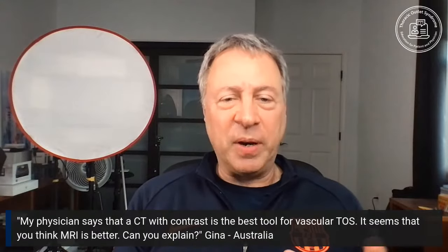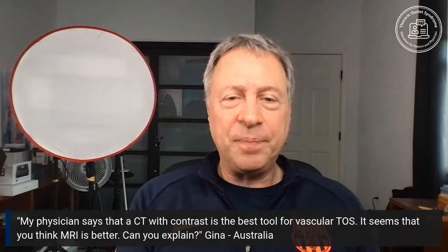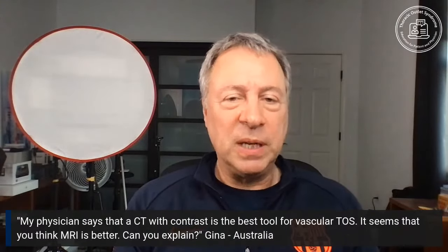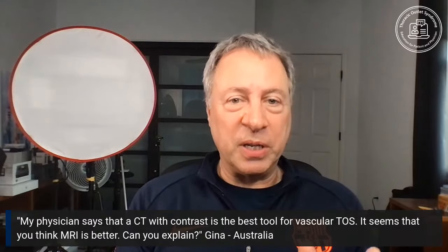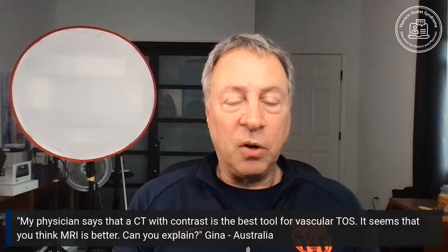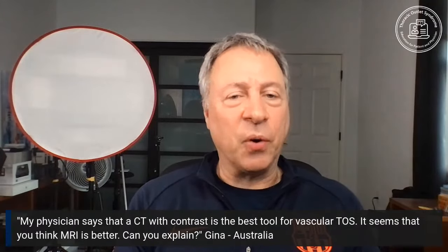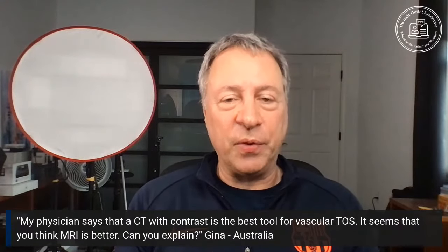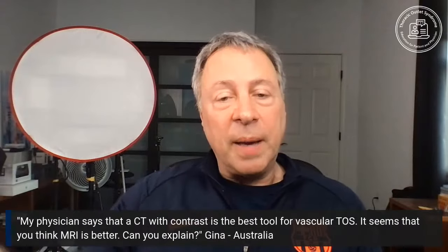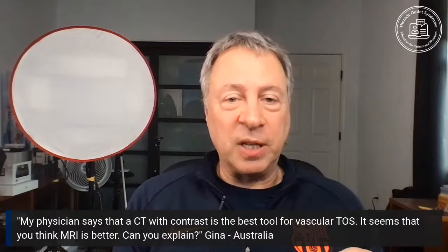To do an angiogram, you have to inject dye or contrast. If your kidneys are in good shape, it's not a problem. If you have a little bit of kidney dysfunction, you have to be careful when you administer this X-ray dye. Also, a CAT scan gives you a pretty high dose of radiation. Not a problem for a one-time scan, but every dose of radiation you get should be thought through carefully. Now, MRI doesn't give radiation, and the dye that it uses does less damage to the kidneys. It's a safer dye to administer.